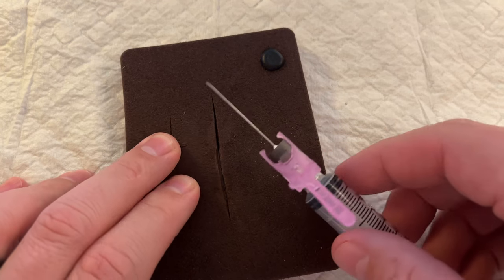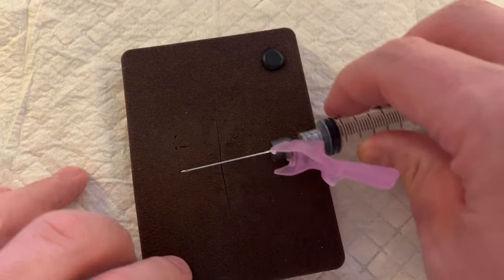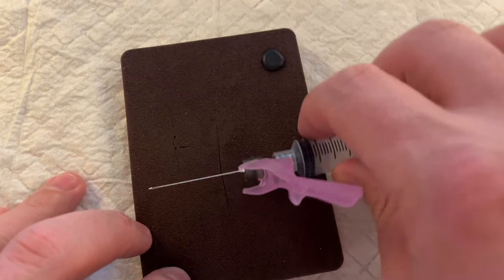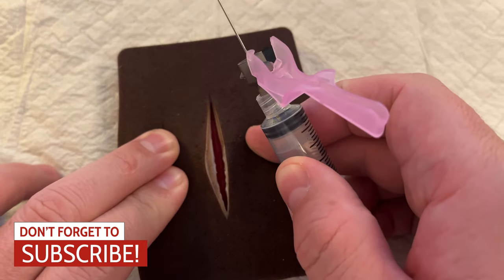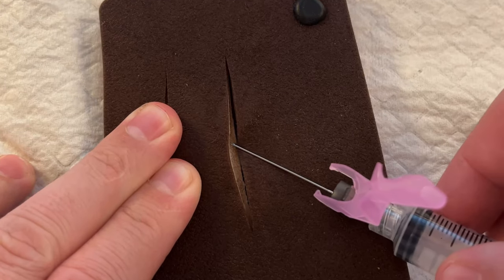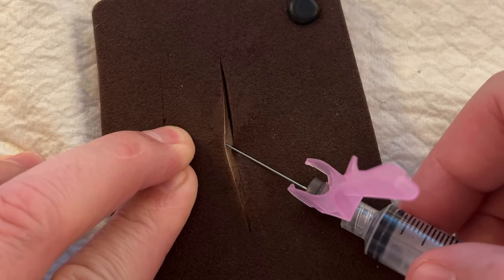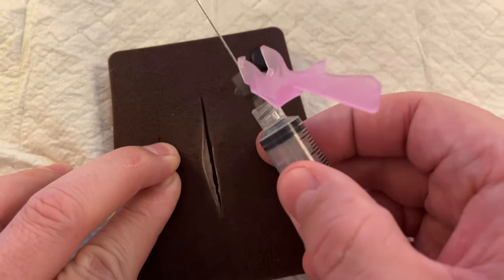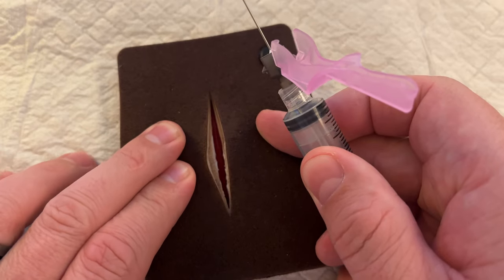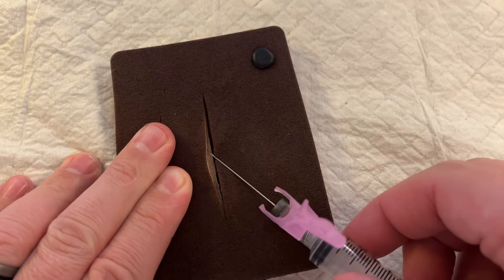There are two main ways to do this. One way is called fanning, where we're going to inject in a fan-like pattern from the middle of the laceration. To do this we want to make sure that this is a pretty clean laceration, because if you were to do this with the needle deep in the laceration you could be pushing dirt and debris further into the tissue. So you only want to use the fanning method if it is a clean laceration, or perhaps an incision in the operating room or procedure room where the patient's already been anesthetized before the incision was made.